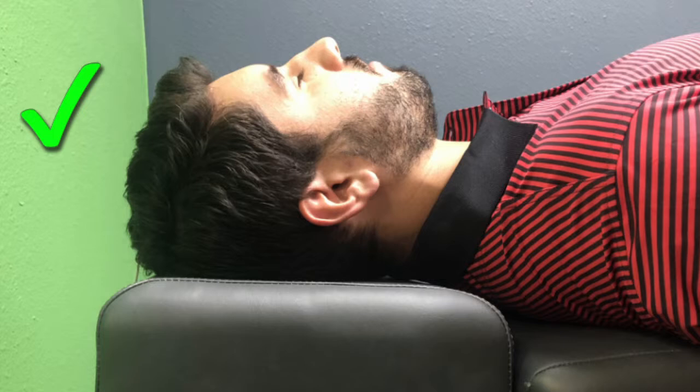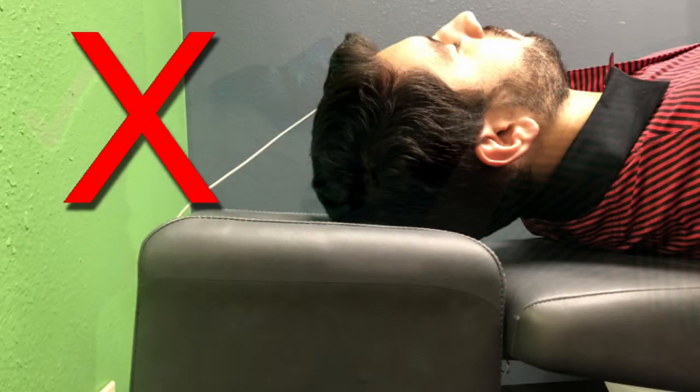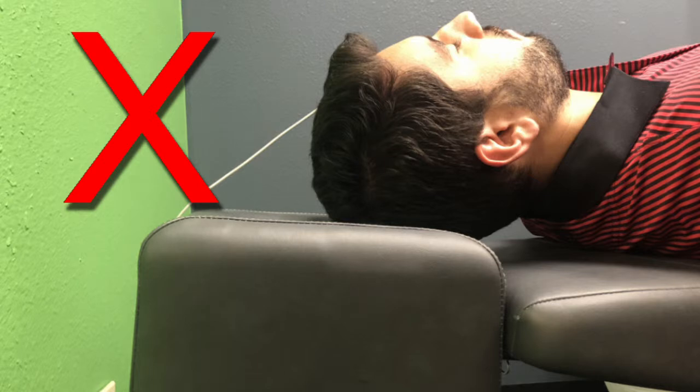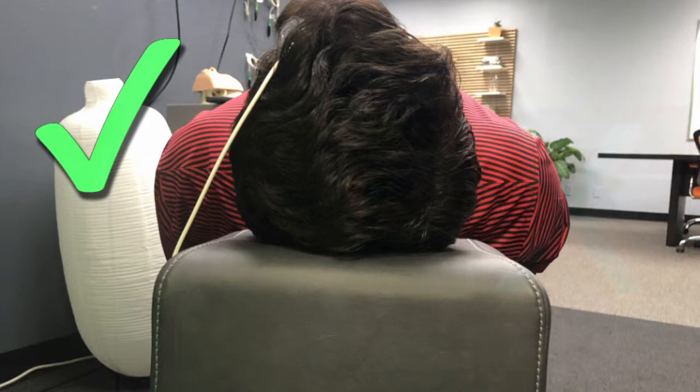Ensure the patient's head will be centered on the headrest throughout the procedure. Rotation of the head is okay, so long as the patient's head stays centered. Pay close attention that the patient's head does not move outside of the limits of the electromagnetic field, as this could result in the reduction or even temporary loss of the signal being communicated with the navigation system. If the navigation signal is lost during the procedure due to the position of the patient's head, bring the patient's head back into the center of the headrest to reobtain the navigation signal.